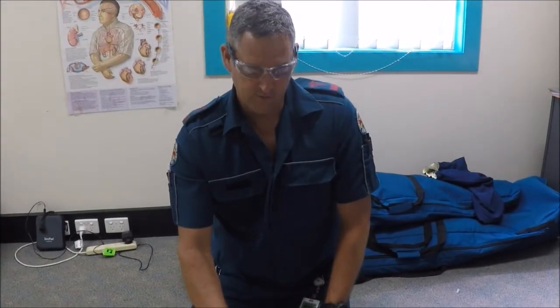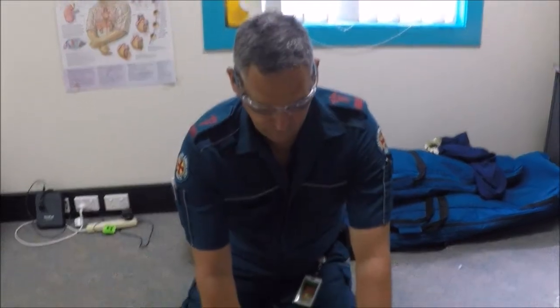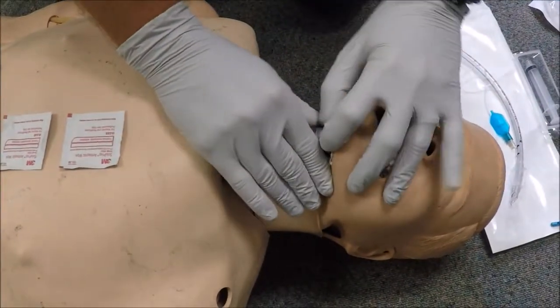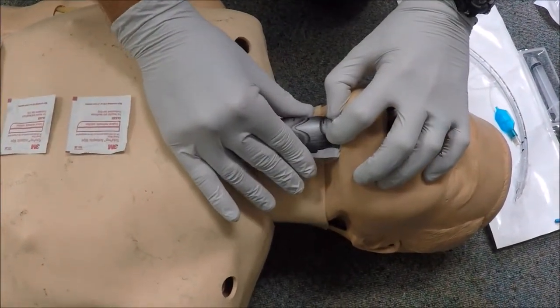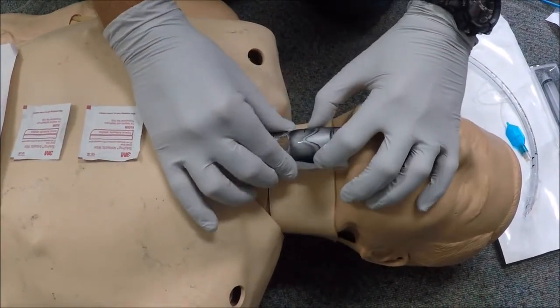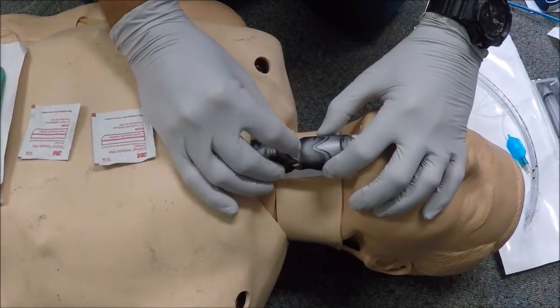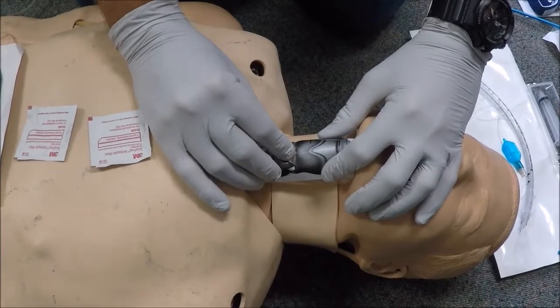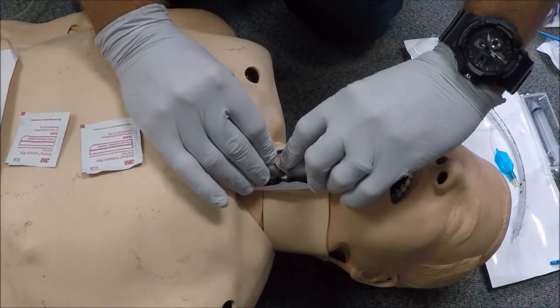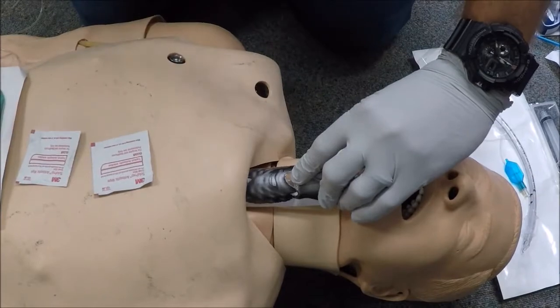So demonstrating the landmarks and how to find the cricothyroid membrane, we use what Rich Leverton refers to as his laryngeal handshake. You find the hyoid bone, and then maintaining a wide grip, you come down over the thyroid cartilage till you've located the thyroid cartilage, continue lower till you find the cricoid cartilage, and then with your dominant hand you find the cricothyroid membrane. Once you've located the cricothyroid membrane, you can swap to your non-dominant hand, maintaining position of the cricothyroid membrane, and get ready for the procedure.